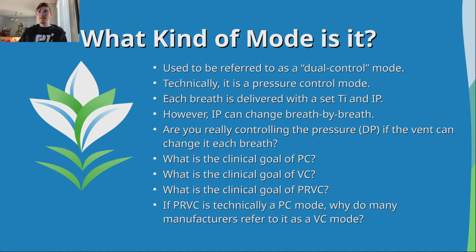And here's some food for thought. If PRVC is technically, according to the experts, a pressure control mode, why do many manufacturers refer to it as a form of volume control? Why is it called pressure regulated volume control by the folks at Servo? Why is it called volume control plus on the PB machines? Why is it called volume control with autoflow on the Drägers? Maybe because even if it's giving pressure controlled breaths, it functions more like a volume mode.